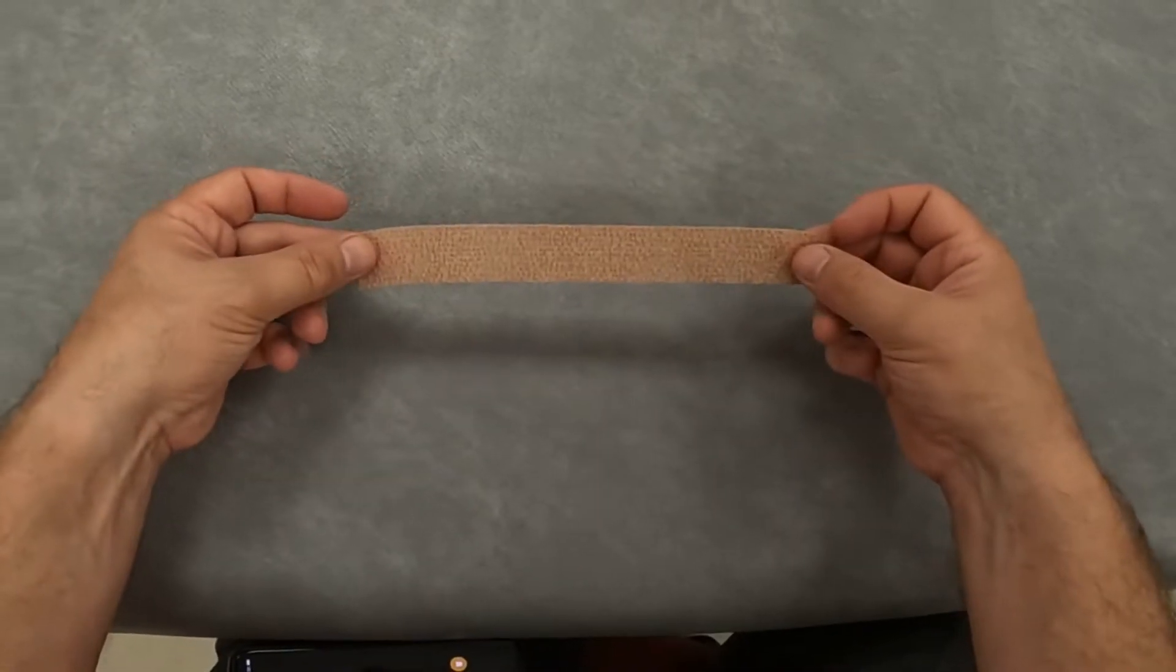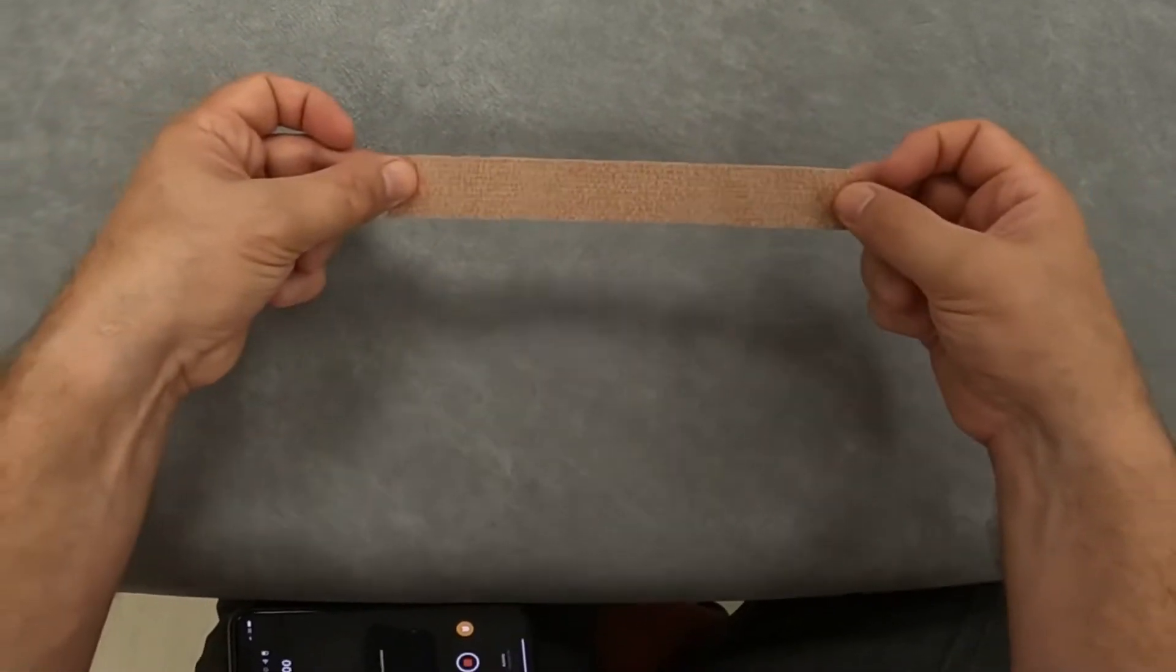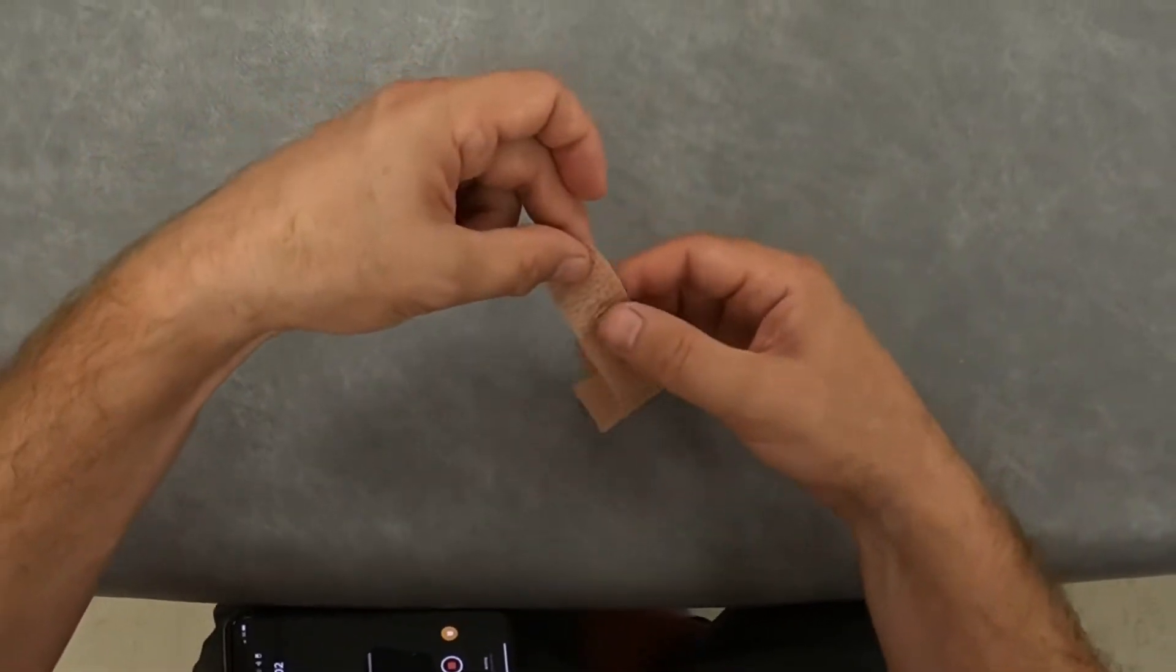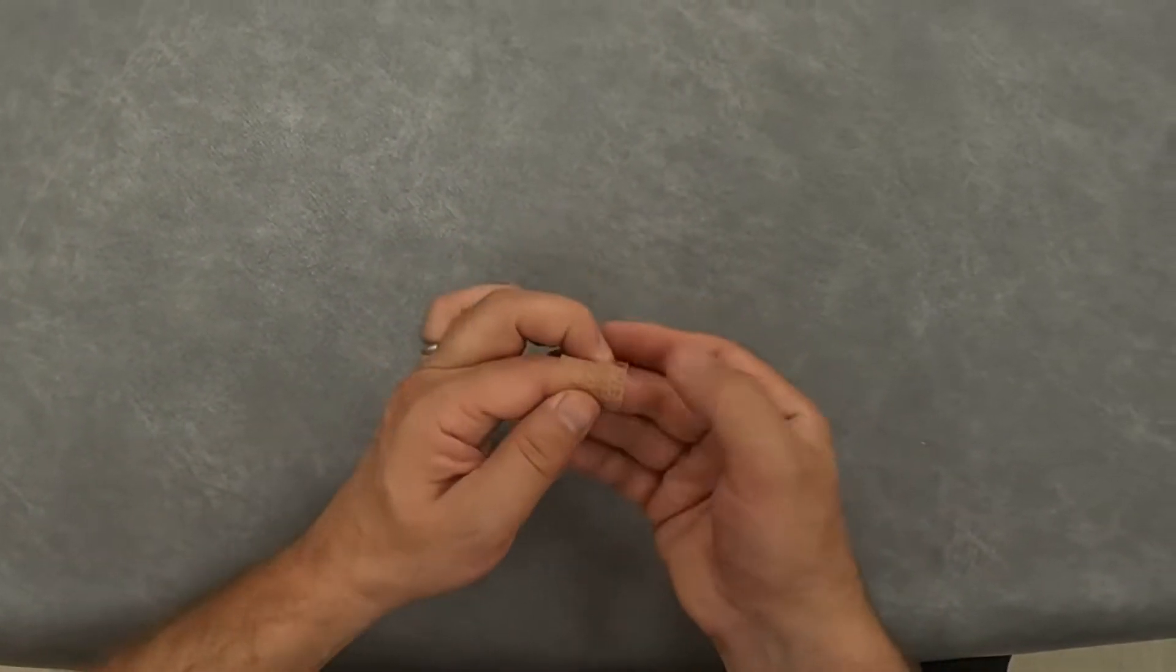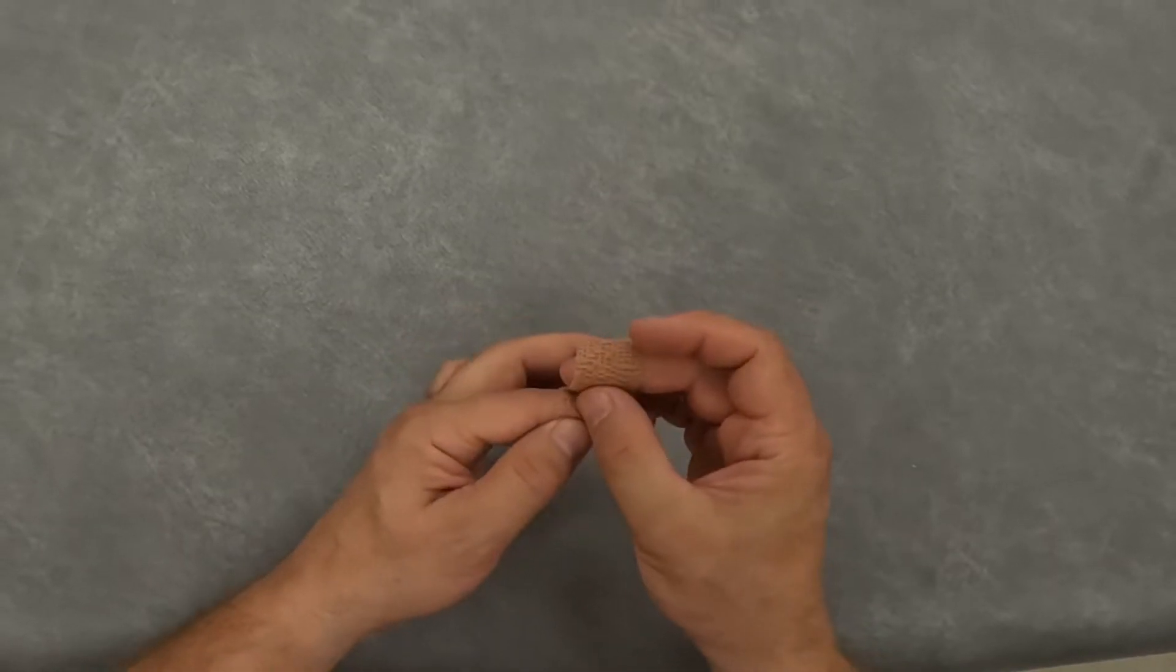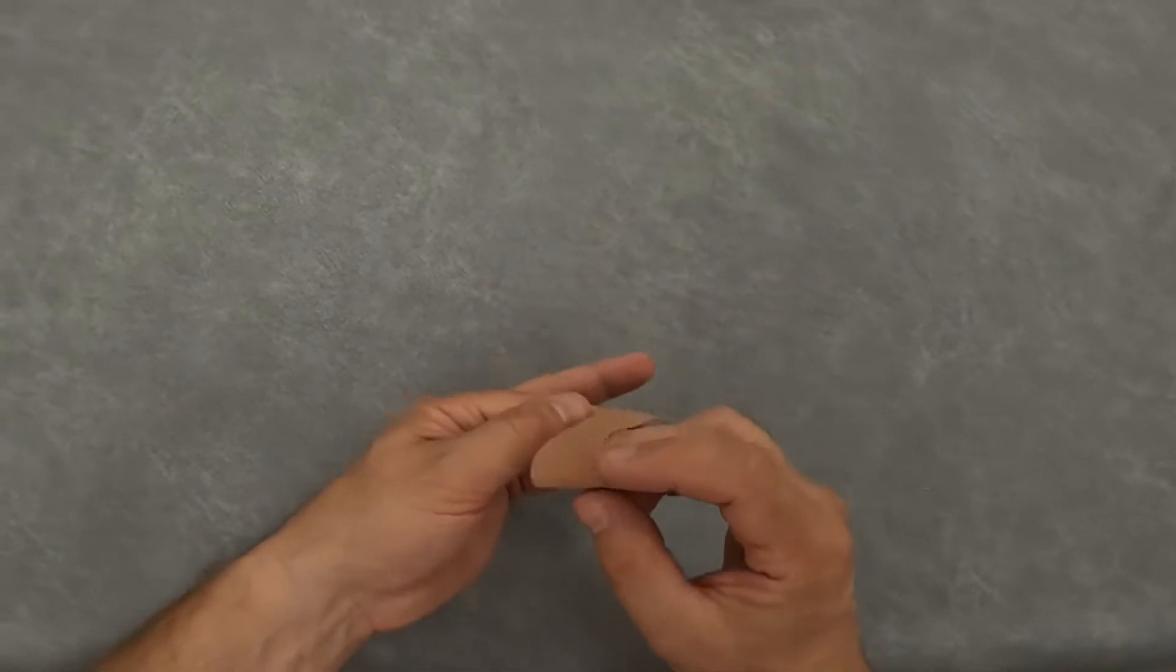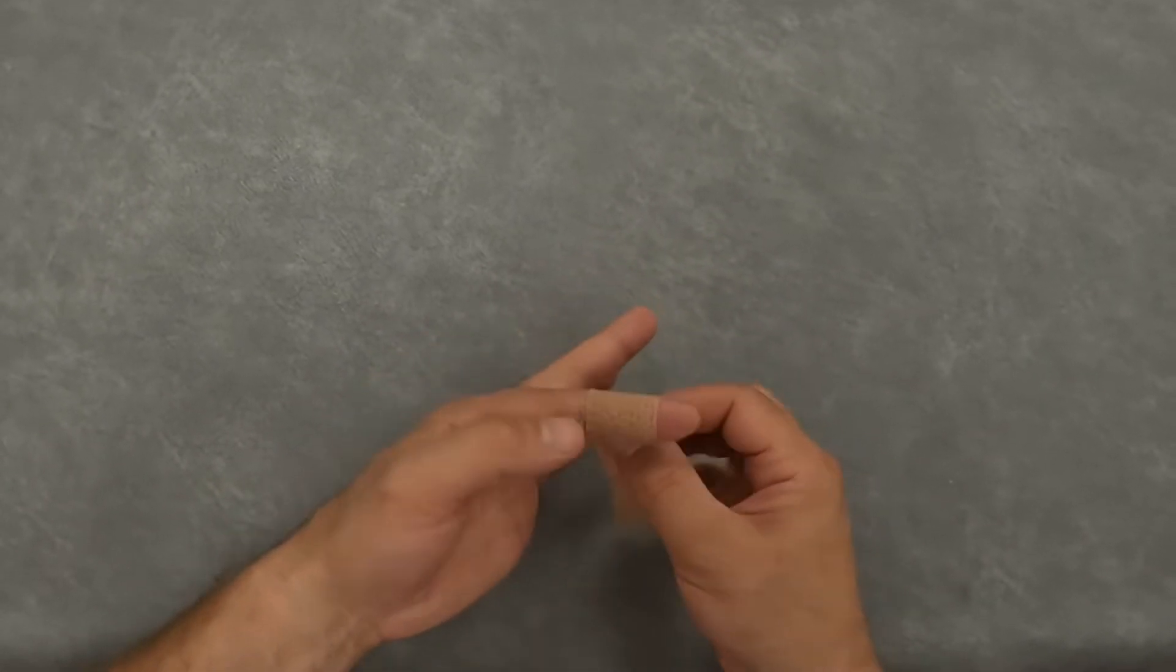Wrap it slowly around the affected joint, in this case a DIP finger joint. Put a bit of tension in with every wrap, not too tight though or you'll cut off the circulation. The end of the finger shouldn't change color or you've done it too tightly.